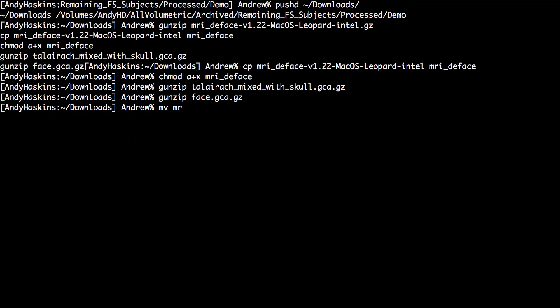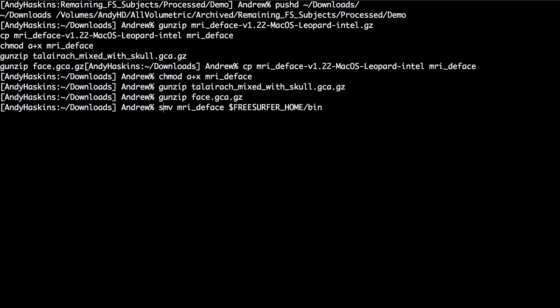I recommend moving the MRI D-FACE command to a directory that is linked to your path, such as FreeSurfer Home slash BIN. You may have to use sudo to do it.